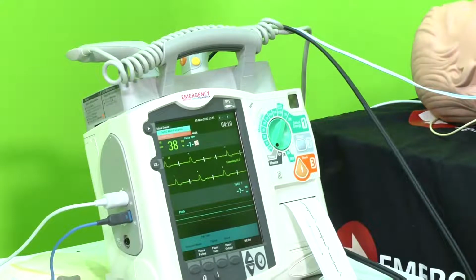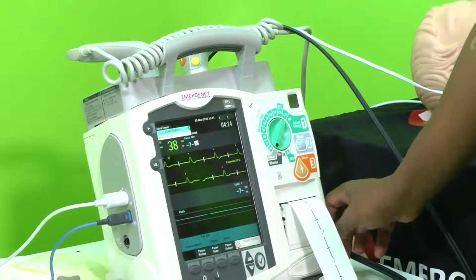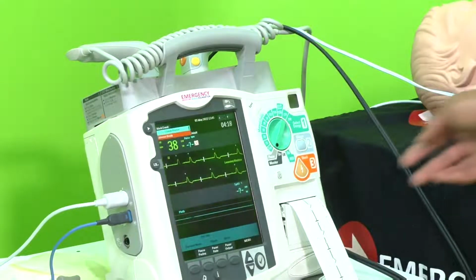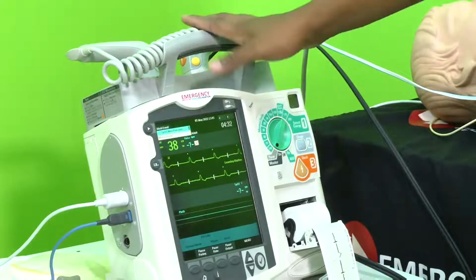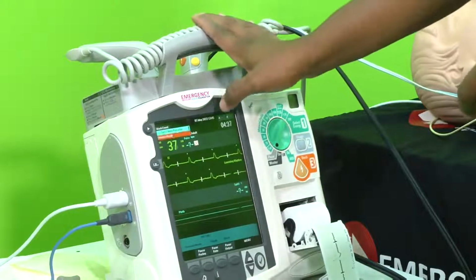So remember, in a bradycardia, the heart rate is extremely slow. I'm just going to reduce that because I want to conserve a bit of our paper. And what you want to do is take over the SA node function in terms of generating rhythm, using pace spikes being delivered by the pacing machine, or the defibrillator in this case. All right, so I've started pacing.